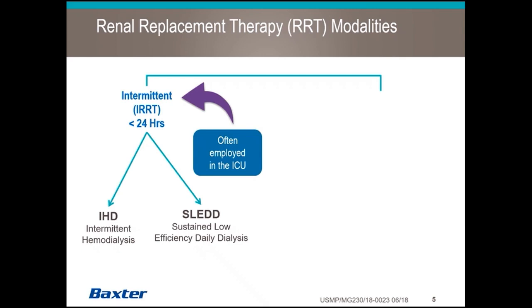There is a derivative of IHD called SLED, sustained low efficiency daily dialysis, that, like IHD, uses dialysate solution to target small molecules and to remove fluid. But SLED is different from IHD in that instead of being a 3 to 4 hour treatment every other day, SLED, or sustained low efficiency daily dialysis, is just that. It's performed on a daily basis.